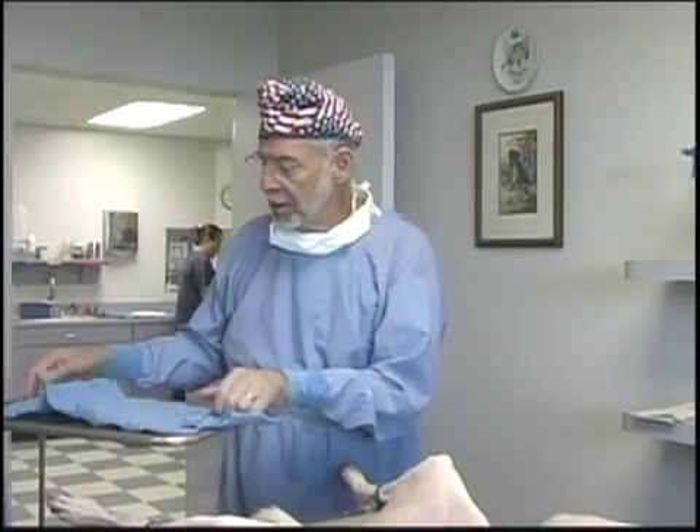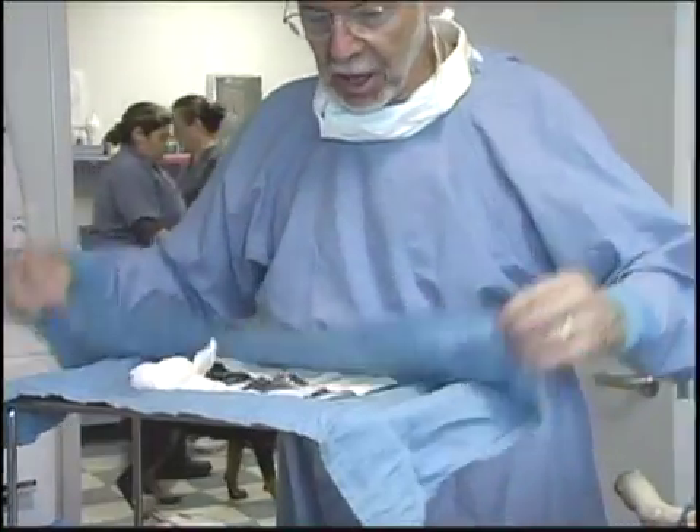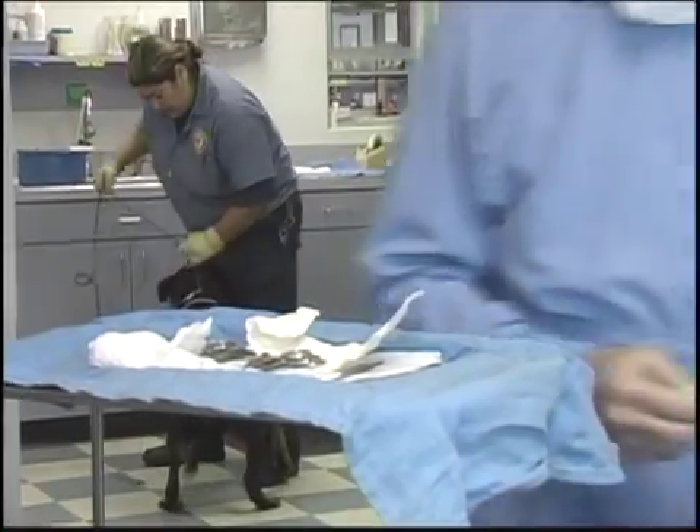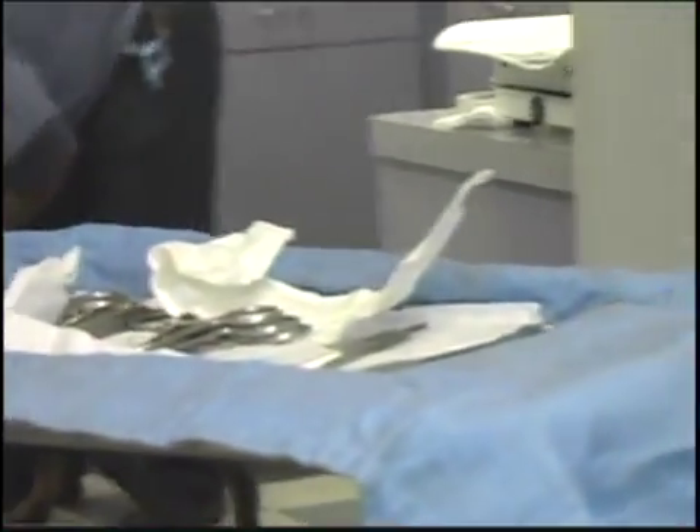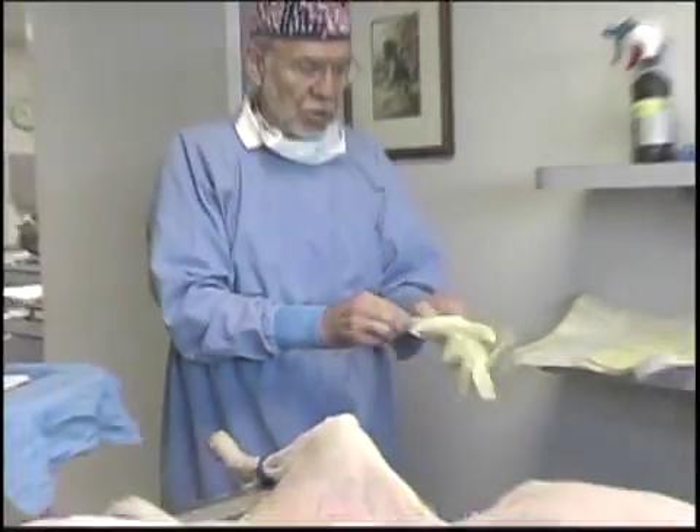Our packs are individually wrapped. We've got tapes on the inside and tapes on the outside. And I want to show the simplicity of the number of instruments that I use for our surgeries — our speed spay, speed castration surgeries.